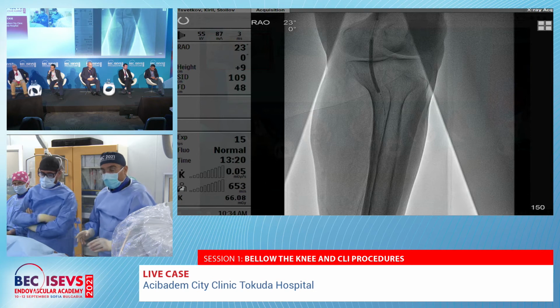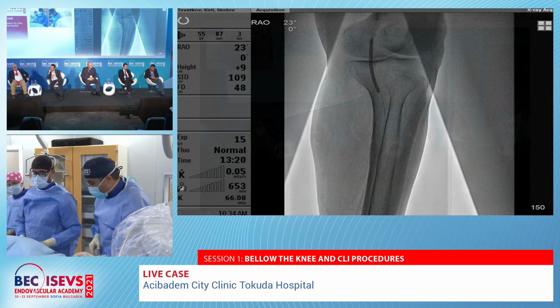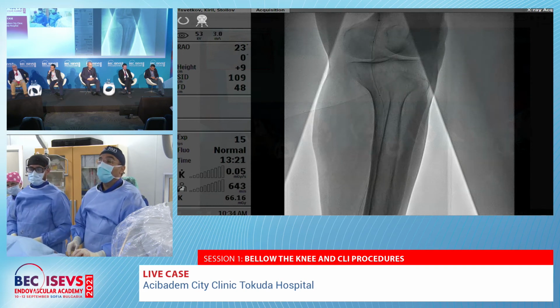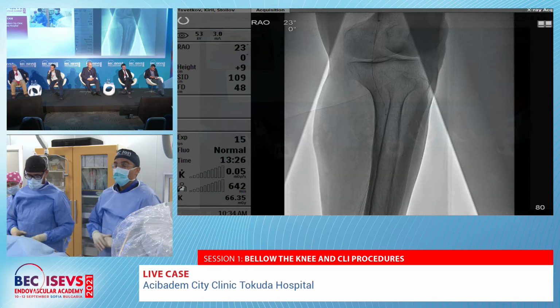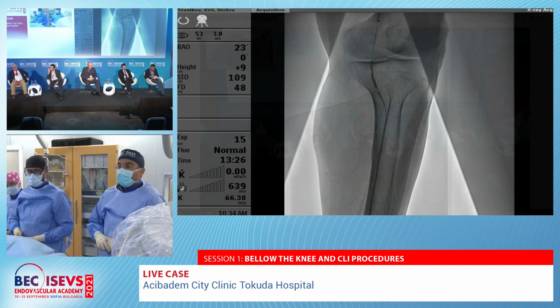Okay, let's open it a little bit to see what happened. I'll go a little bit down. Okay, because here was the biggest problem. Okay. Slow again. Yep.